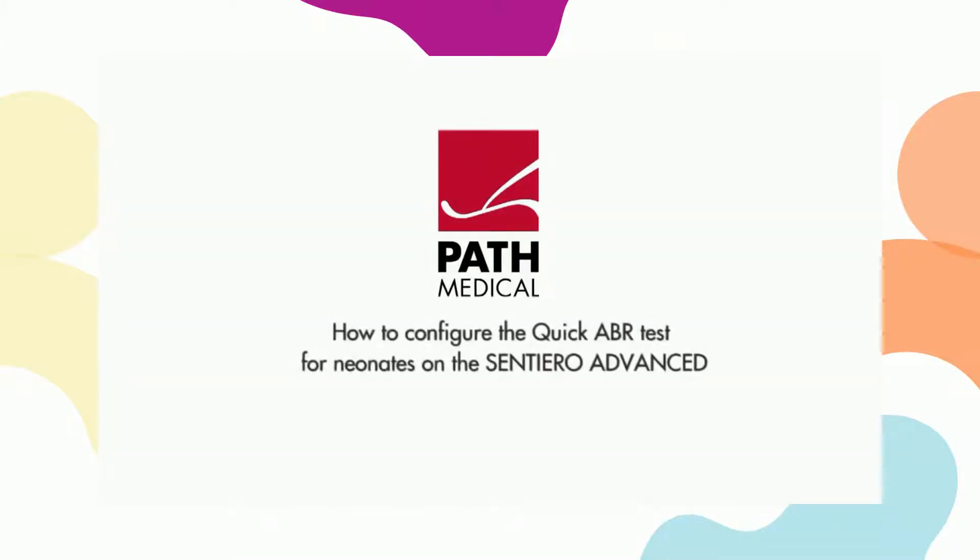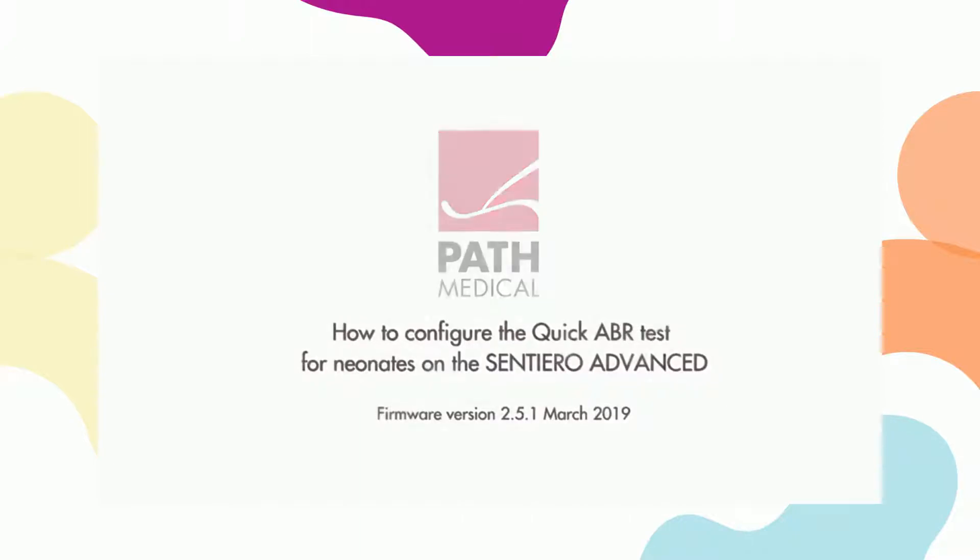This is a PATH medical training video on how to configure the Quick ABR test for neonates on the Sentiero Advanced.